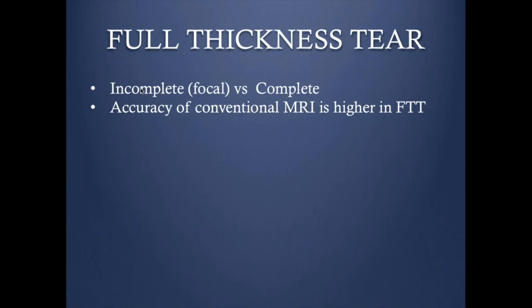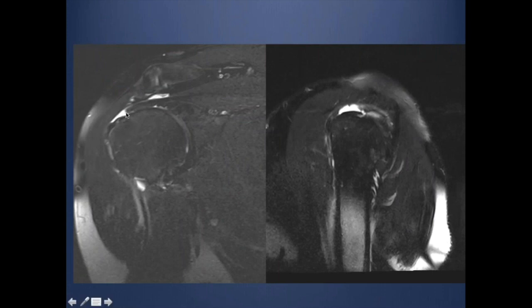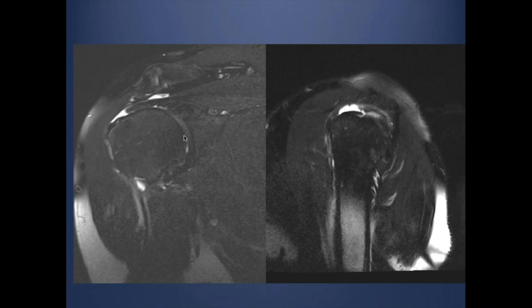The full thickness tear, as we said, could involve only part of the tendon or the whole tendon may be torn. The accuracy of conventional shoulder MRI is very high and is as good as arthrogram. You can see a fluid signal intensity with complete discontinuity of the tendon extending from the bursal to the articular surface. In the sagittal, the posterior part of the tendon is still intact. So whenever you see a tendon tear, you must look at both coronal and sagittal — this is essential.